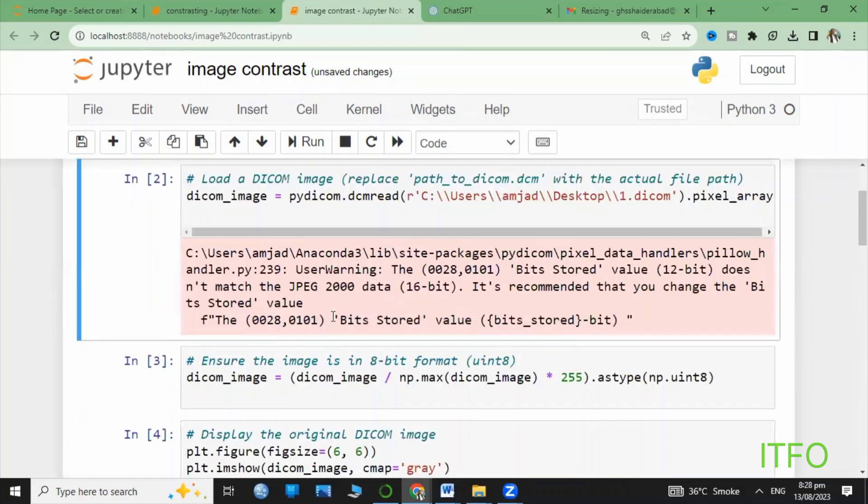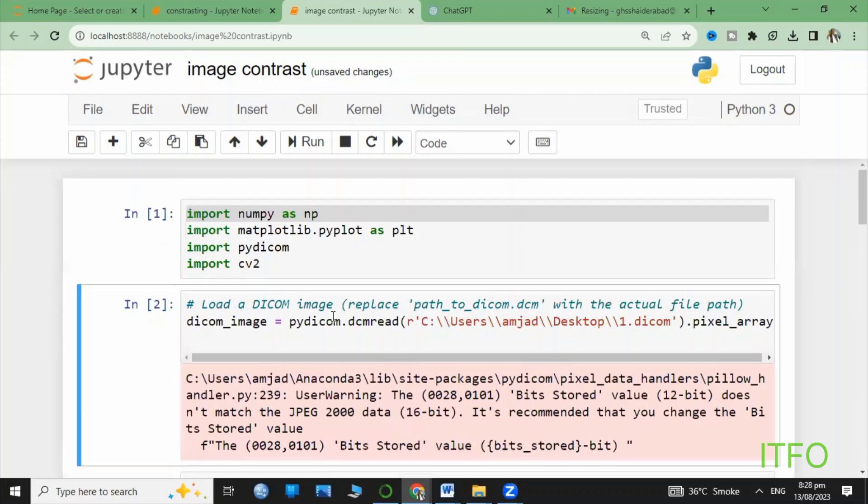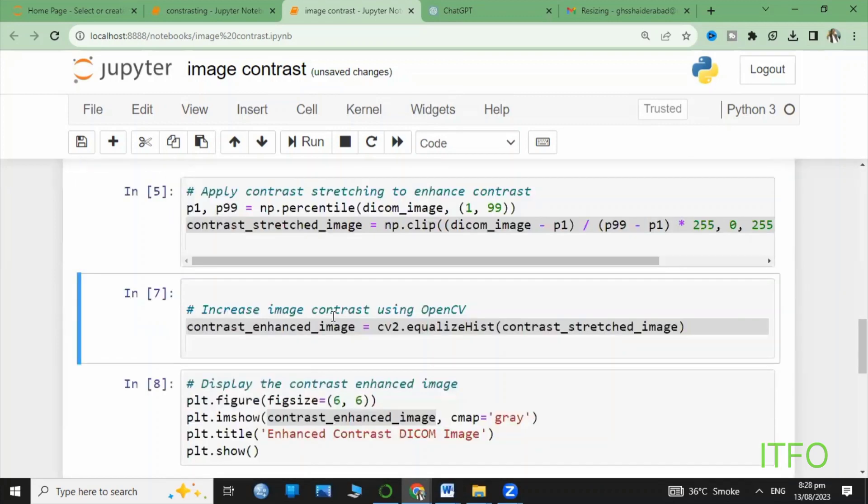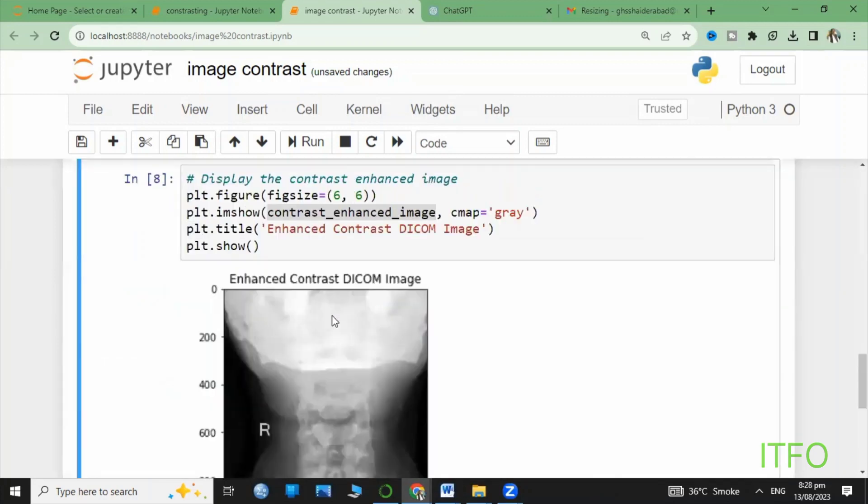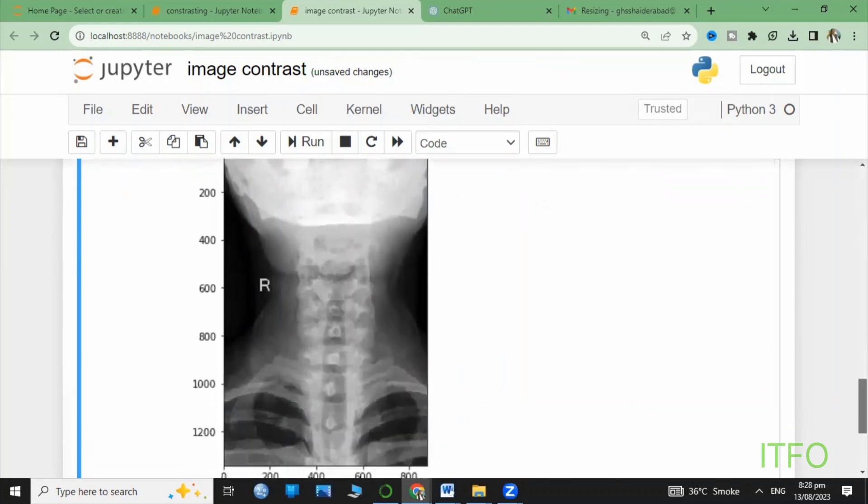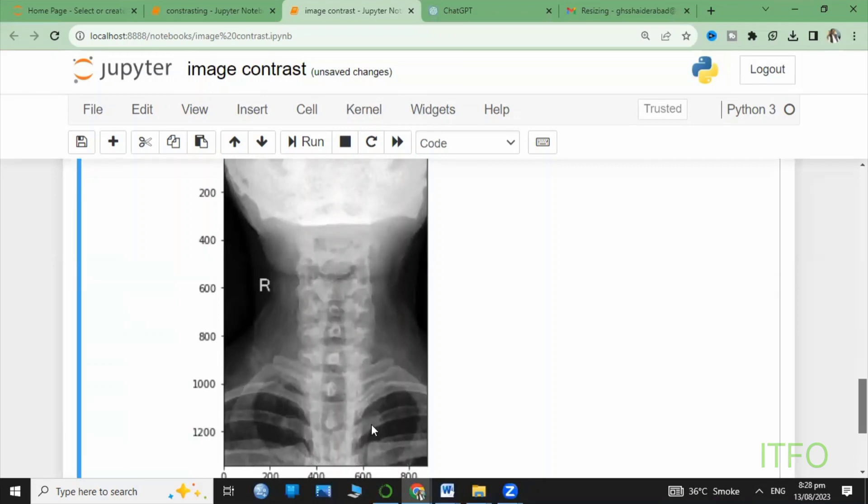We have successfully applied contrast enhancement to our medical images. Remember, enhancing image contrast can improve the visibility of details and structures in medical images, leading to better diagnostic capabilities.